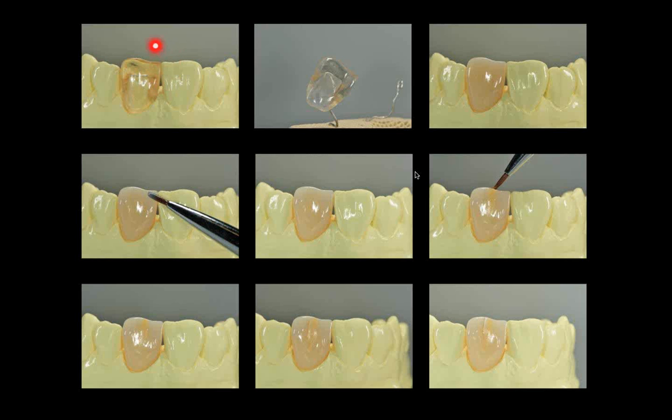What we have been doing in our lab is when we mill a Suprinity crown like you see here, we always polish it, okay? So when I do a Suprinity crown, before I go through the crystallization process, you will not find this in any of the manuals. I polish them because, first of all, it polishes very easily in this stage. You can grind. I'll show you after what kind of grinding instruments I use. We rubber wheel it, and then we even diamond paste it so it shines like this. Then I go through the crystallization process, and it comes out like this after crystallization.